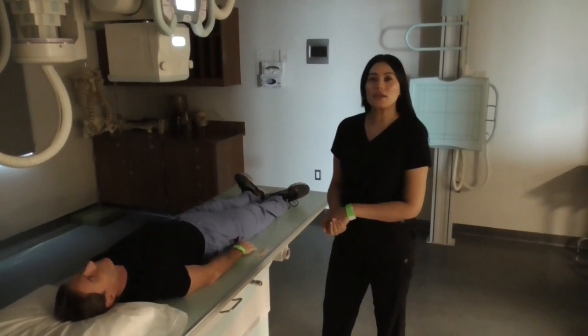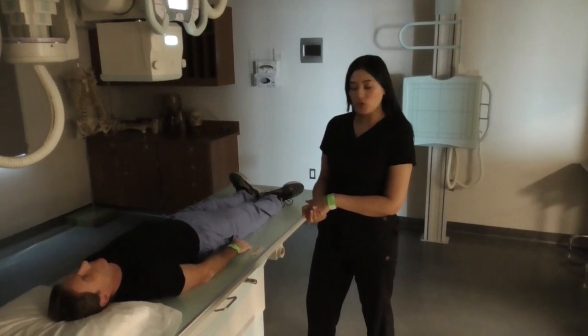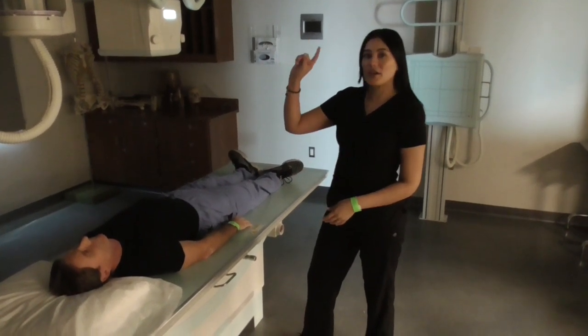I will now be demonstrating an AP abdomen, also known as a KUB. We will be using a 14 by 17 lengthwise, 40 inch SID.